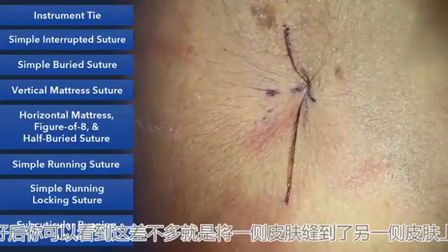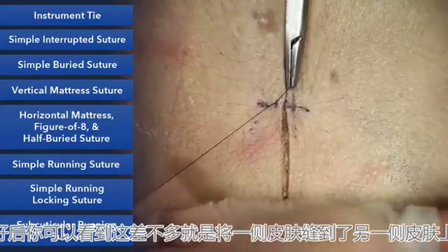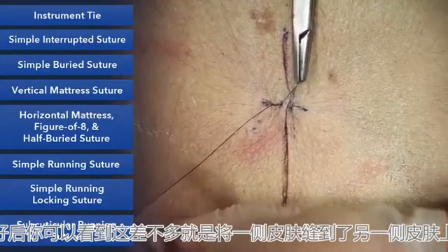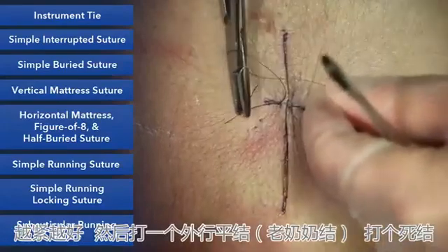And what you'll see when we tie this down is that this approximates and everts the skin edges, and we can make it just as tight as we want. And we have our granny knot, and that'll hold it. And we'll square our knots.